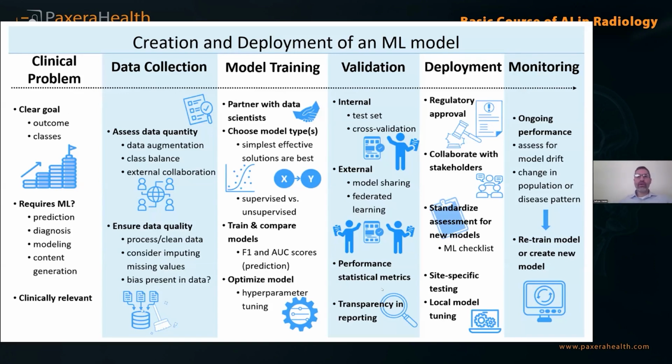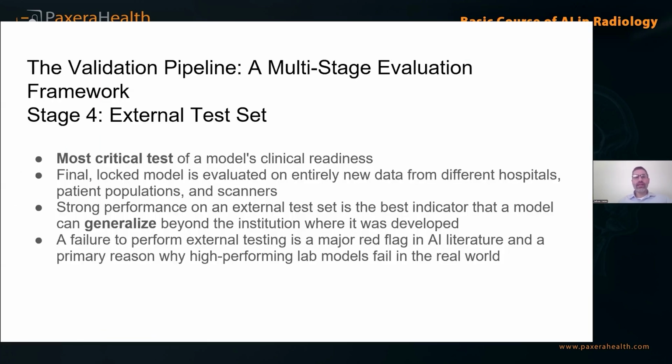I really wanted to focus on the clinical problems which face clinicians and physicians and patients. I'm going to touch briefly on the validation piece and talk a decent amount about the deployment and challenges around the deployment and monitoring. So I just wanted to emphasize how important these validation pipelines are. I'm not going to go into the whole developing an algorithm. This is not that talk, but I really want to talk about how critical the external test set is of the data.